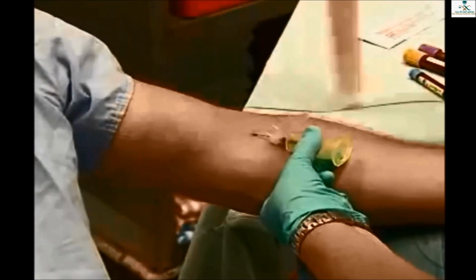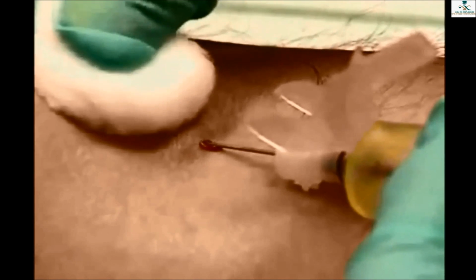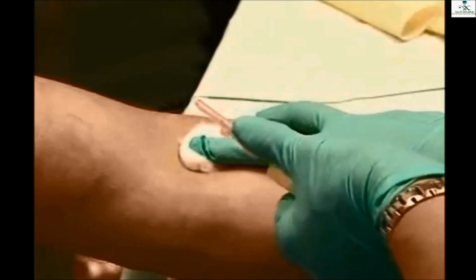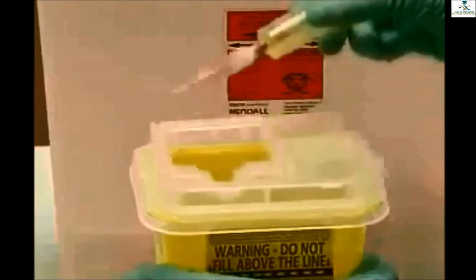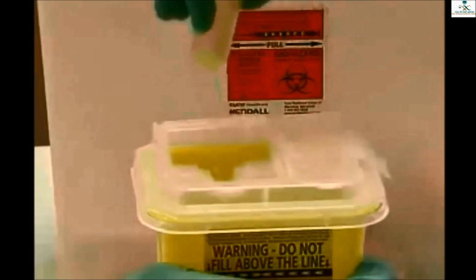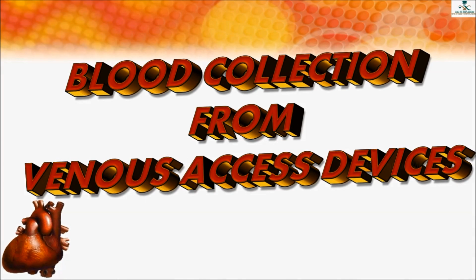Remove the tourniquet. Remove the needle and apply a piece of cotton to the withdrawal site. Secure the needle. Discard the needle in the sharps container. Then we move to the next chapter, which is collection from venous access devices.